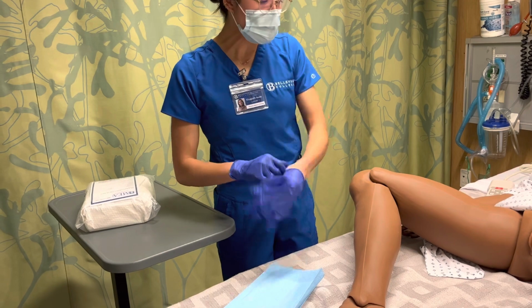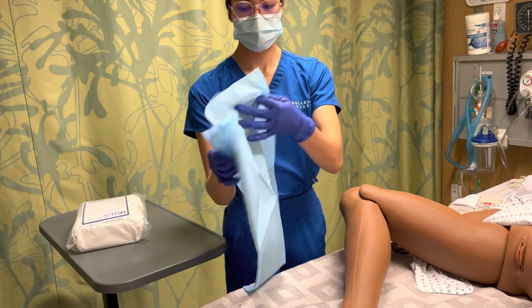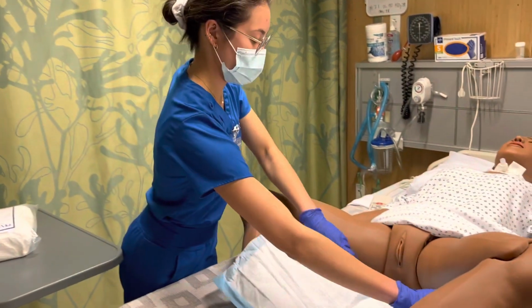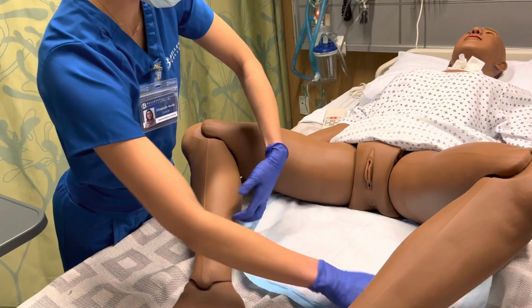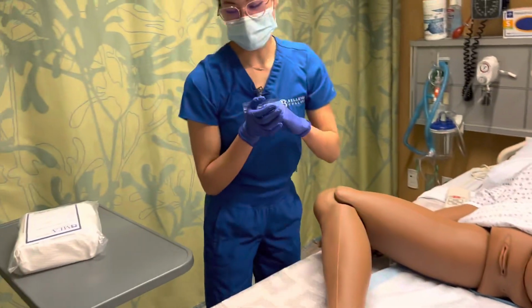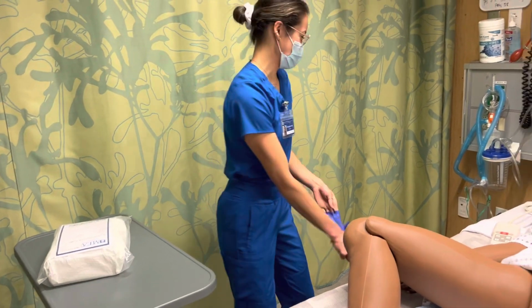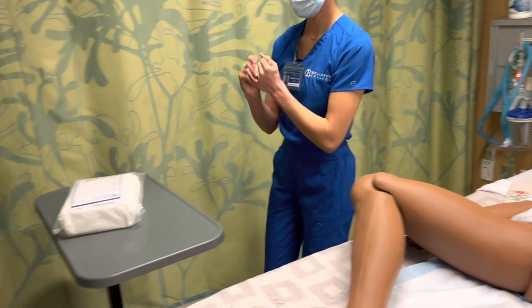Residual fluids. Tuck this. Okay. Now we're ready to set up our sterile field. Perform hand hygiene again. Okay.